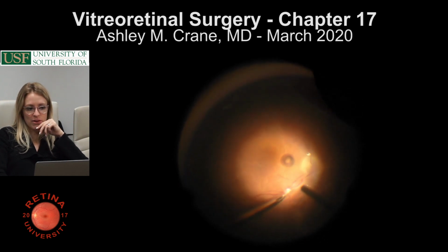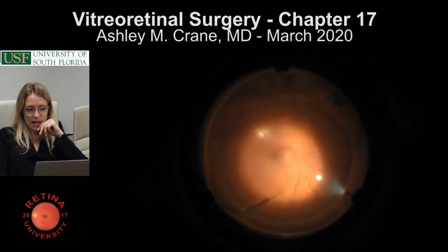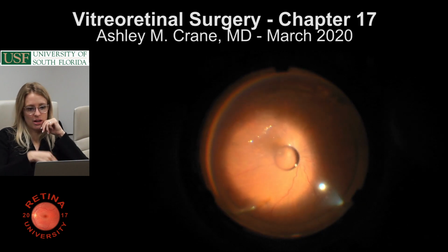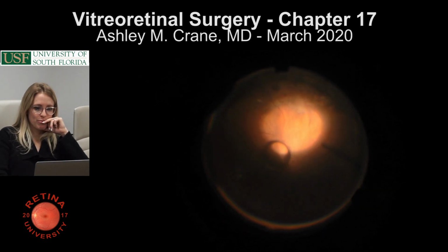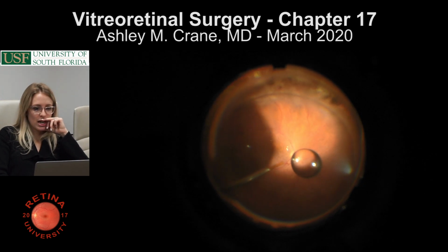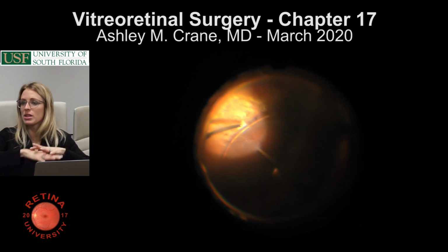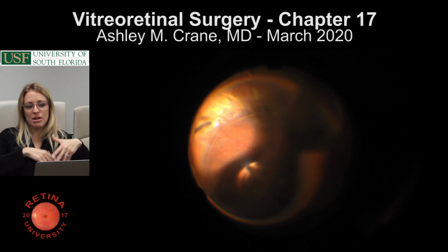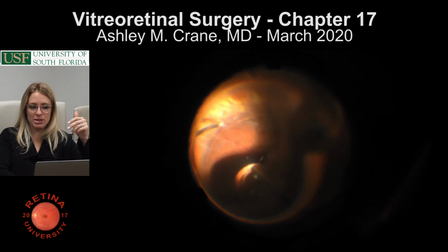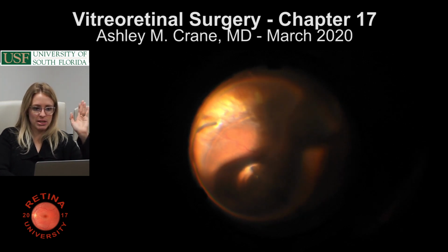So I can't remember if we peel something there or not, but basically now really just looking for PVR membranes. We're peeling some of those membranes off the surface of the macula. It's much harder to do under that PFO than not under the PFO, but you're forced to do it because it was so bullous. And when you put the PFO down, you can see if it's going to flatten, which it probably is not, because why would it have detached unless there was a break? And so then basically maybe you're picking at some membranes, and then here's the retinectomy is going to start.